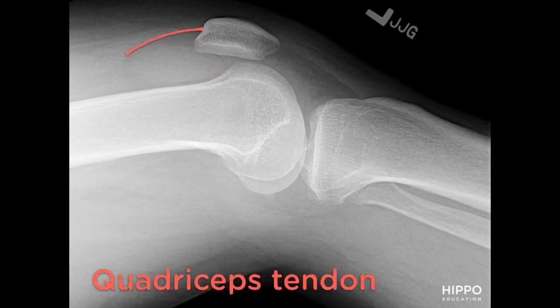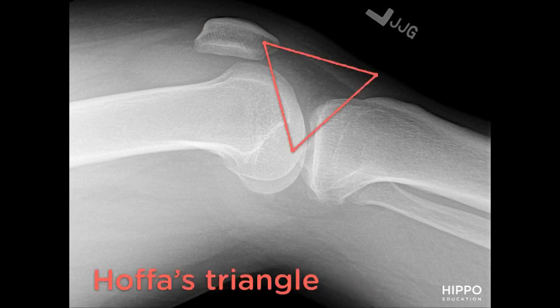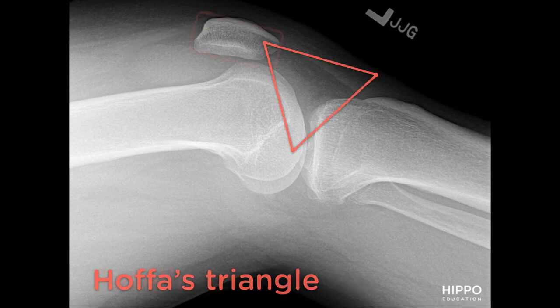Depending on the severity of the knee effusion, you may see bowing of the quadriceps tendon as well as blurring of the posterior border of the quadriceps tendon by the effusion. Depending on the severity of the knee effusion, you may see fluid density in Hoffa's triangle, as you can see here, and the patella may be anteriorly displaced.